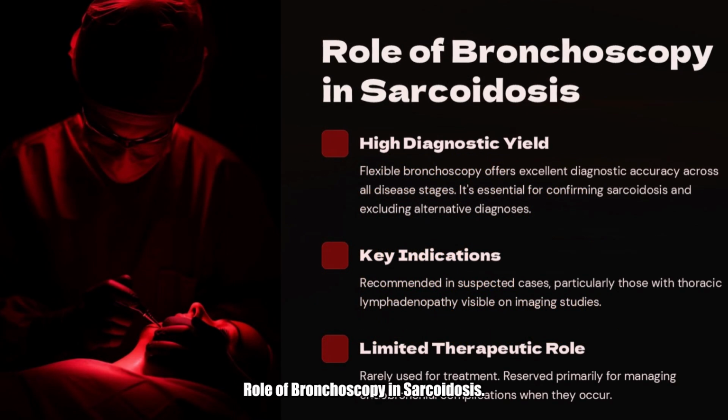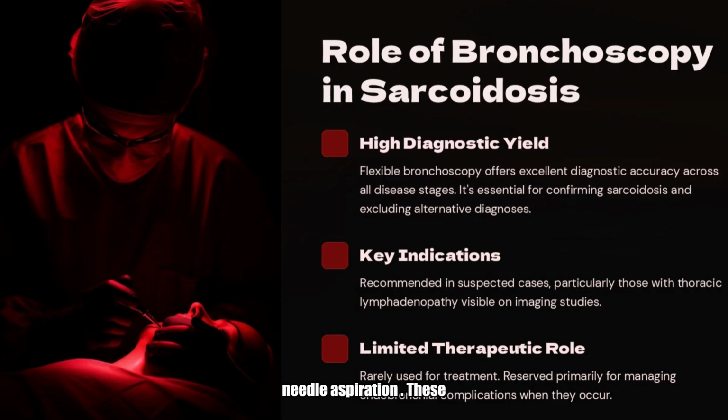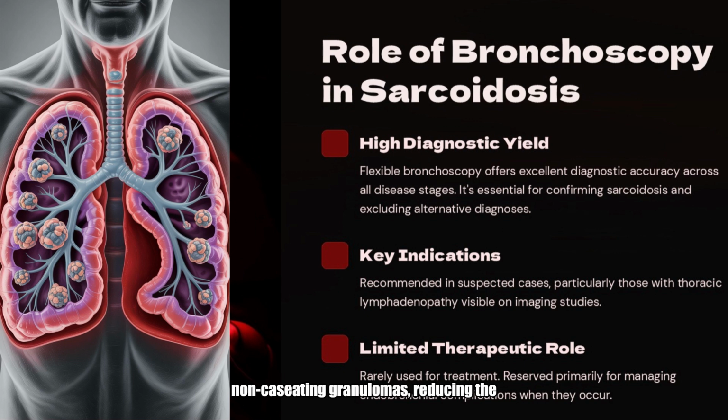Role of bronchoscopy in sarcoidosis. 1. High diagnostic yield. Bronchoscopy offers a high diagnostic yield in sarcoidosis, especially when used with procedures like transbronchial lung biopsy, TBLB, endobronchial biopsy, and transbronchial needle aspiration, TBNA. These techniques help confirm the presence of non-caseating granulomas, reducing the need for surgical biopsy.